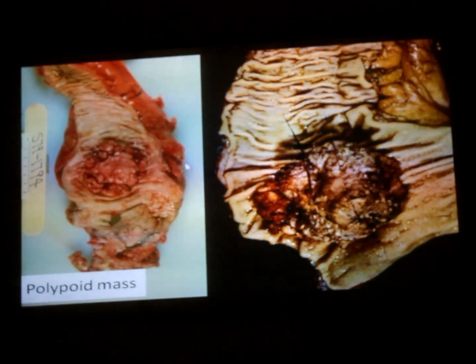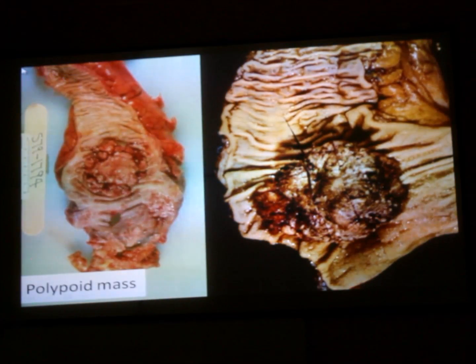So this is another picture. Identify the specimen. You should first identify. This is not lung, this is not heart, okay. This is colon, large intestine. So this is a growth. So you have only one slide of colon. That should be adenocarcinoma colon. You have to write like that.